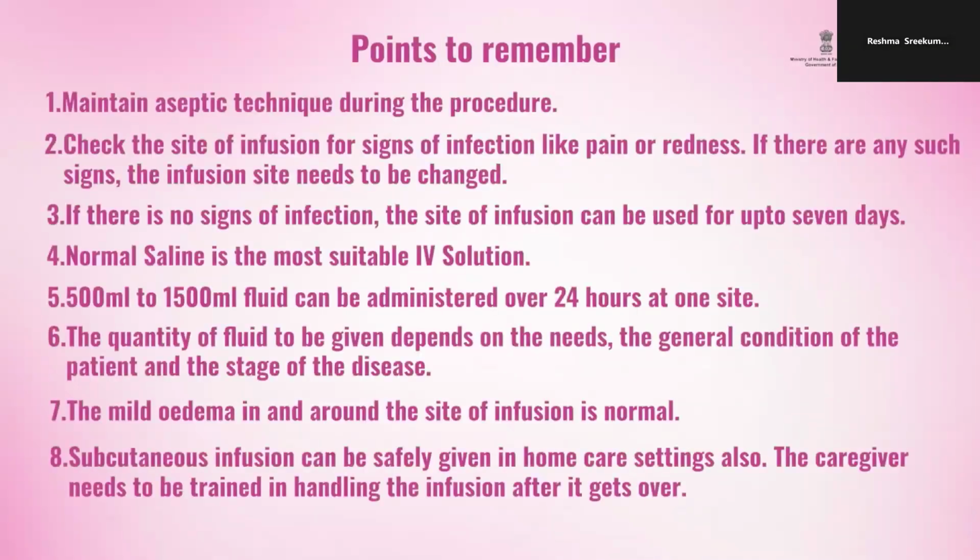Points to remember: maintain aseptic technique during the procedure. Check the site of infusion for signs of infection like pain or redness. If there are any such signs, the infusion site needs to be changed. If there are no signs of infection, the site of infusion can be used for up to 7 days. Normal saline is the most suitable IV solution.